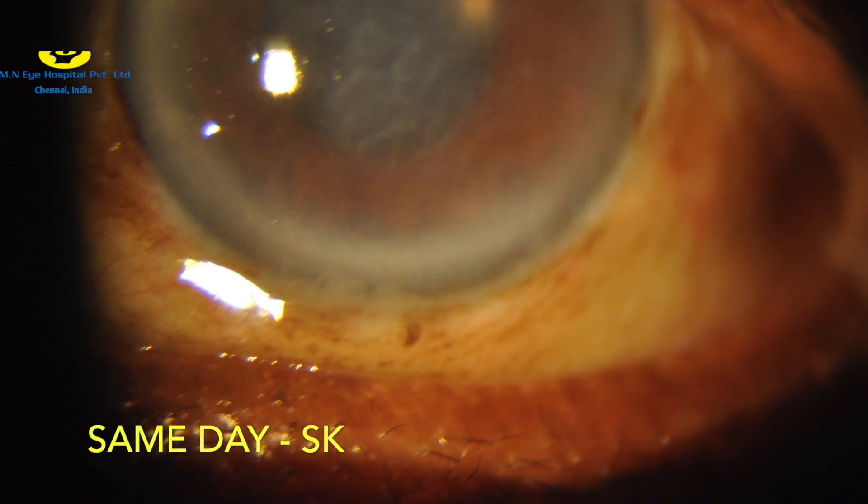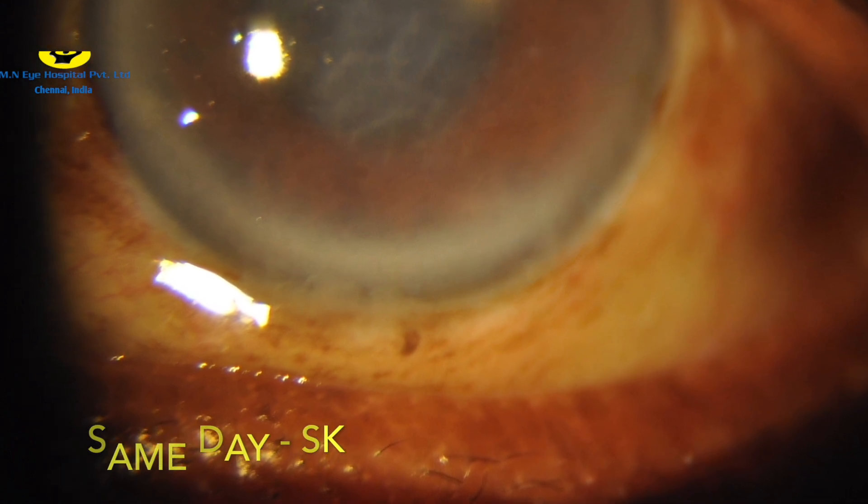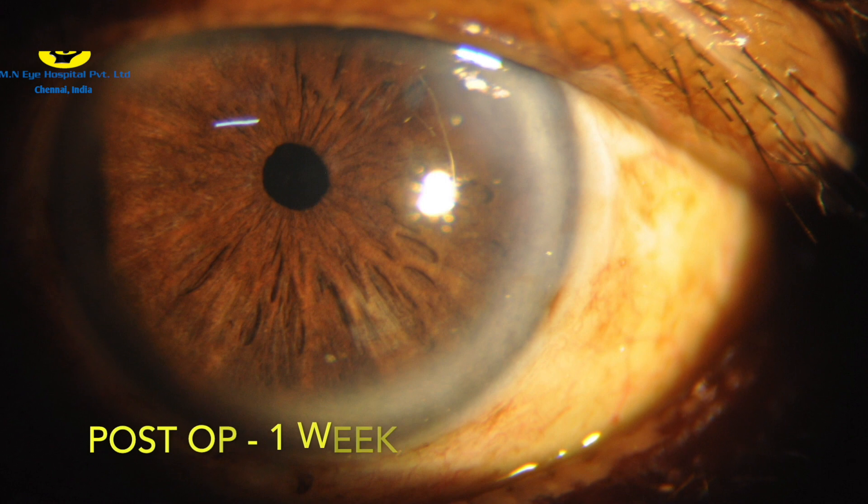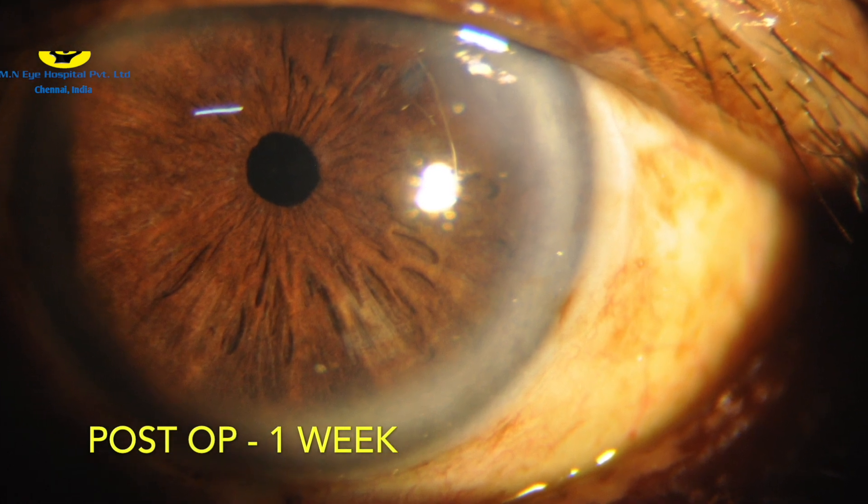As was expected in all hard mature cataracts, six-hour post-operative findings showed moderate Descemet's striae. But with appropriate usage of medications, one-week post-op showed a clear cornea, well-rounded pupil, and a happy patient.